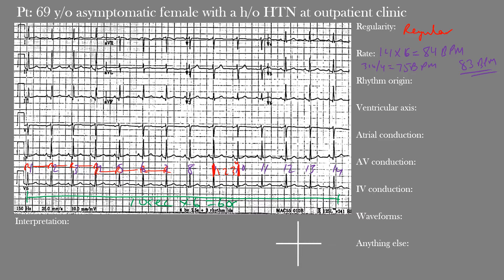Moving to rhythm origin: we have narrow QRS complexes, so the rhythm must be supraventricular in origin — originating from above the ventricles. We can also make out clear, defined, similarly-shaped P waves. We need to ask ourselves: are we dealing with sinus rhythm? To confirm sinus rhythm, we want to look at a few leads to see if we have upright P waves. Remember, when we draw a simple box diagram of the heart, the right atrium is here, the left atrium here, the right and left ventricles below.